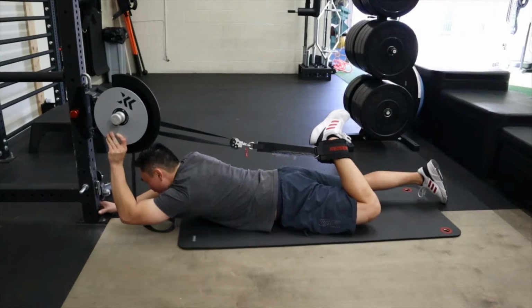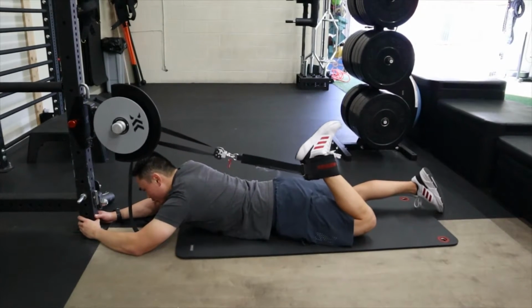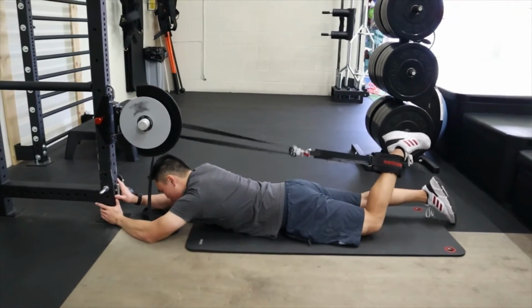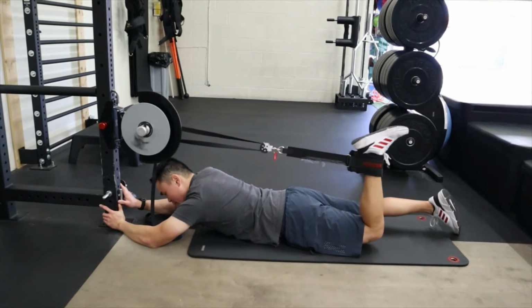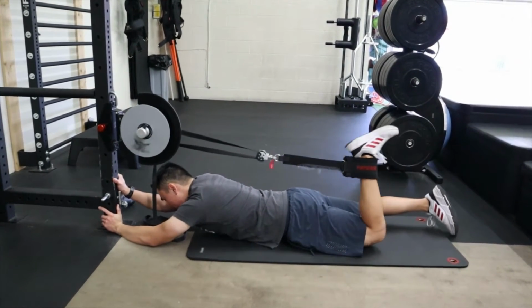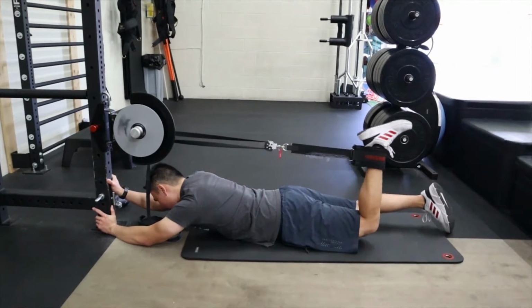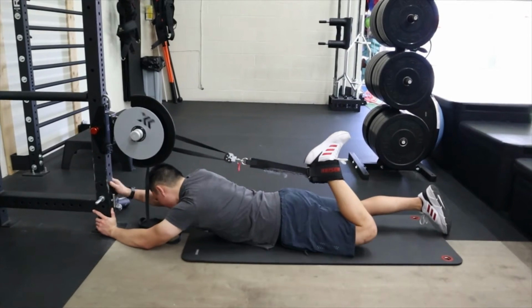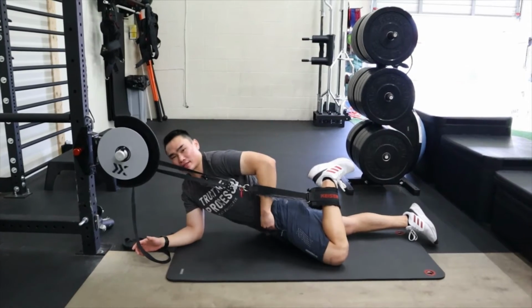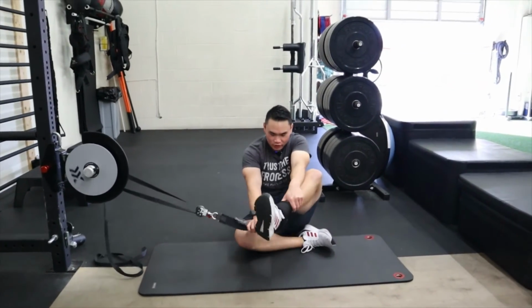But I like to do this, and you just have the patient kick, and then the Kpulley will pull him back, kick, and then it'll pull him back. And make sure you stabilize up here, because the Kpulley will pull you kind of into the rack. So use your upper extremities to kind of stabilize here. And then what you can do, if you're a clinician or a coach, you can just hold their quad down to stabilize their leg as it comes up. So anyways, that's one of my favorite ones to do.